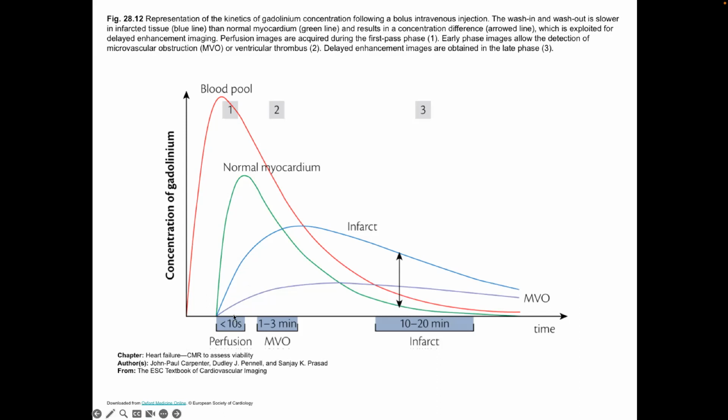So here you would do the perfusion part, right? With that injection, you may as well do a perfusion exam because you have a dynamic injection. When you have this, you have a dynamic process in the sense that the brightness of the blood is decreasing over time, etc. However, you can still make some really nice pictures, right, during here.